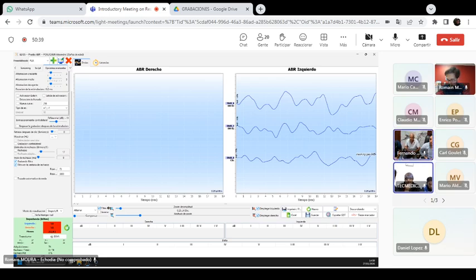Yes, according to my colleague, everything is okay. He just had some fear, he wants to know what to do about the observations on the Helios.